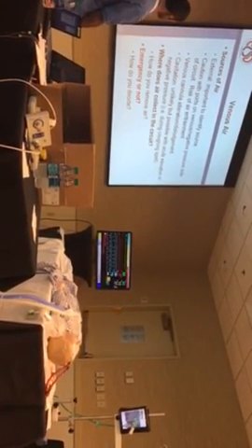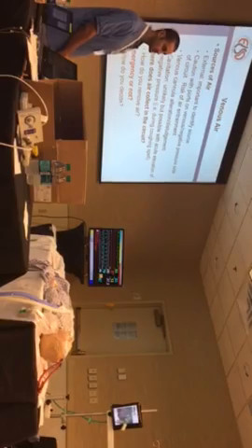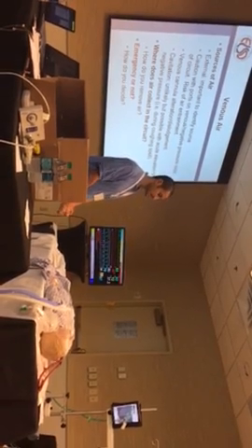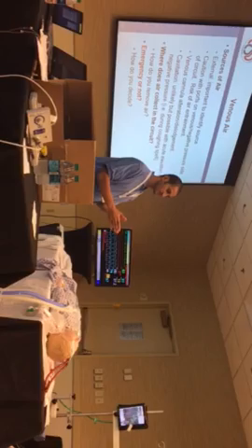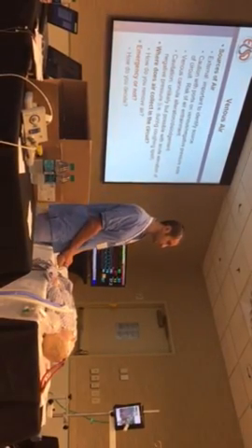So in terms of where does air collect, where do you guys notice air collecting first? So yeah, the pump head, right? The pump head is usually the initial sink where it can catch and stagnate. If it's micro bubbles, the pump usually continues working. If it's a sufficient bolus and you get an air-fluid level in there, it can completely obstruct the movement of the pump and get air locked.